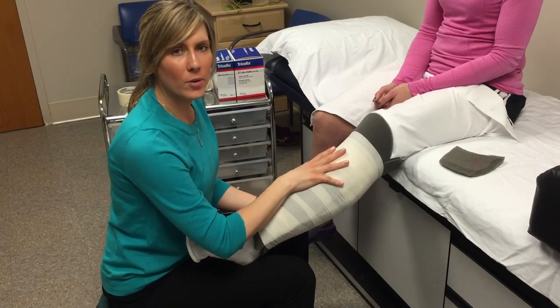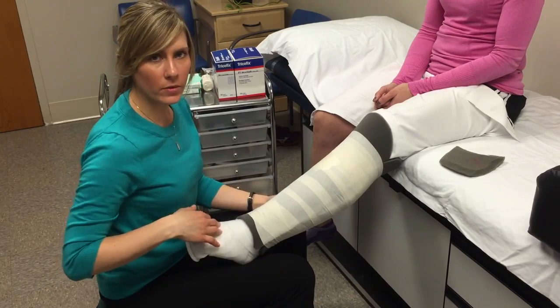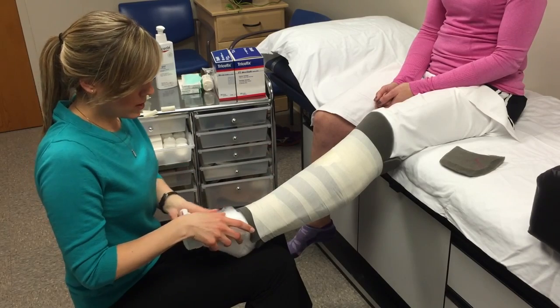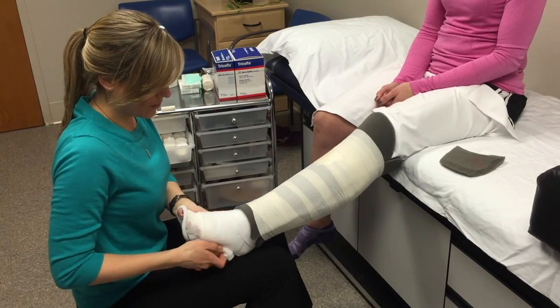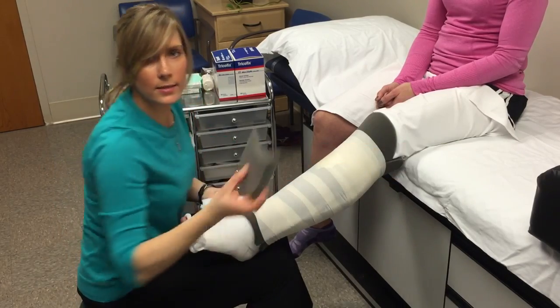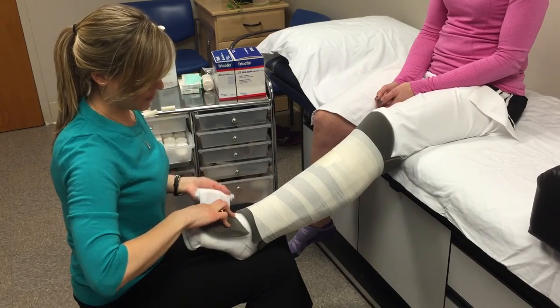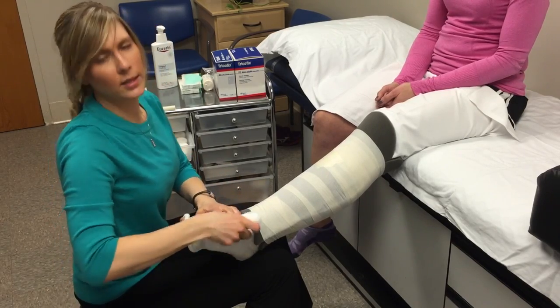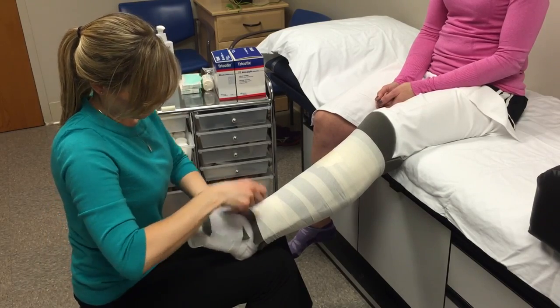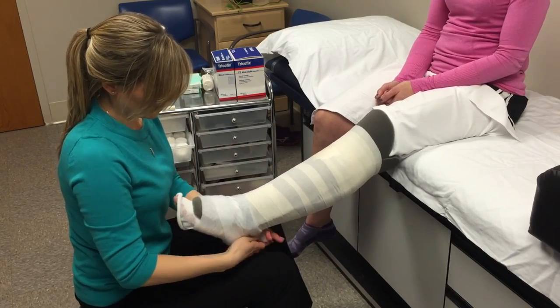Now that you have the foam in place with the gauze and everything's aligned, it's time to put the foam pad for the foot. So I don't have to hold two things at once, I do one loop around the top of the foot with my cotton padding, and now I can simply place the pad on top of the foot and secure it easily. Go ahead and finish the roll.